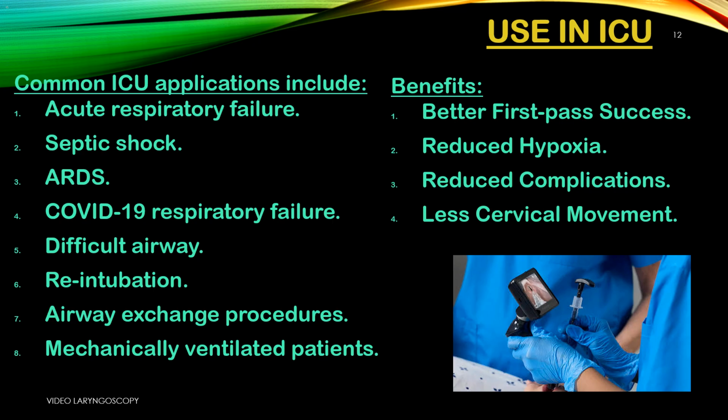VL improves visualization. 6. Re-intubation. After extubation failure, airways are usually more swollen and harder, so VL helps. 7. Airway exchange procedures. Swapping tubes safely. The camera guides placement to avoid losing the airway. 8. Mechanically ventilated patients. For tube changes or bronchoscopy-assisted intubation while keeping oxygenation up.